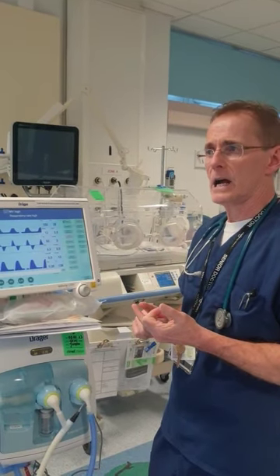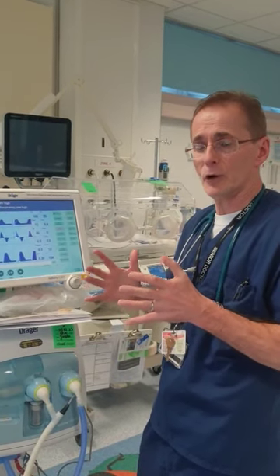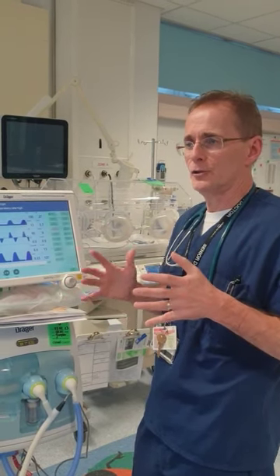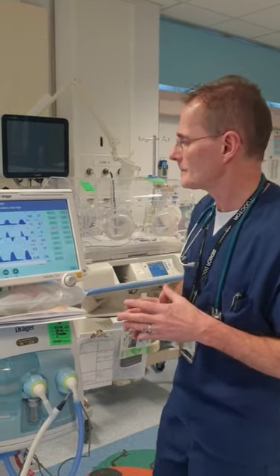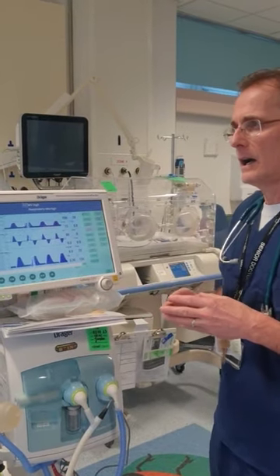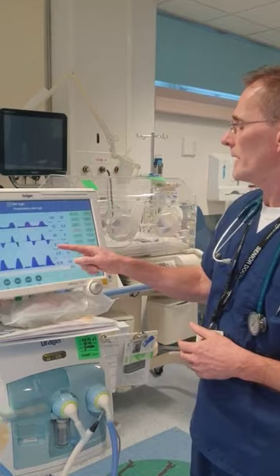The next thing is the amplitude of oscillation. That is the degree of oscillation around a mean airway pressure. That's dictated by amplitude, and we want to get enough amplitude to shake the chest, and maybe if there's an umbilical line in, get the umbilical line shaking. I'll move on now to show you how we go from conventional to oscillation.